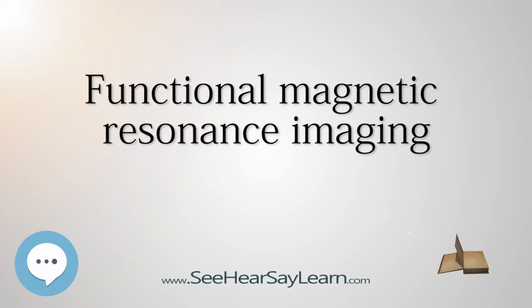BOLD hemodynamic response. The change in the MR signal from neuronal activity is called the hemodynamic response, HDR. It lags the neuronal events triggering it by a couple of seconds, since it takes a while for the vascular system to respond to the brain's need for glucose. From this point it typically rises to a peak at about 5 seconds after the stimulus. If the neurons keep firing, say from a continuous stimulus, the peak spreads to a flat plateau while the neurons stay active. After activity stops, the BOLD signal falls below the original level, the baseline, a phenomenon called the undershoot. Over time the signal recovers to the baseline.